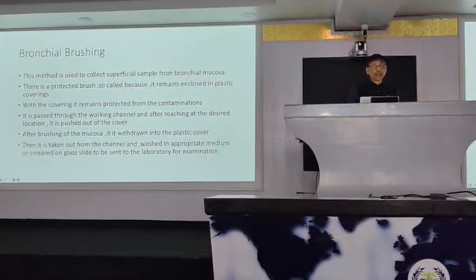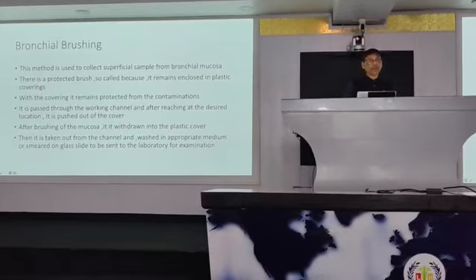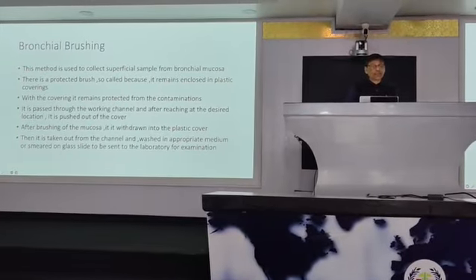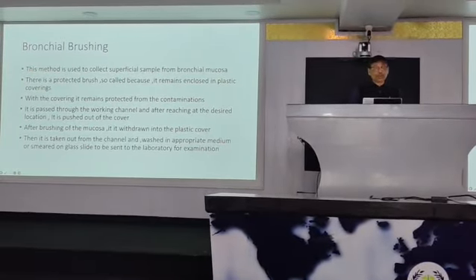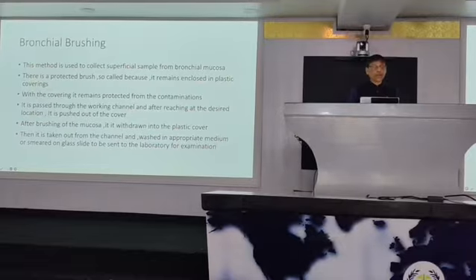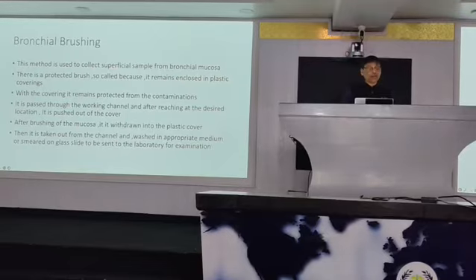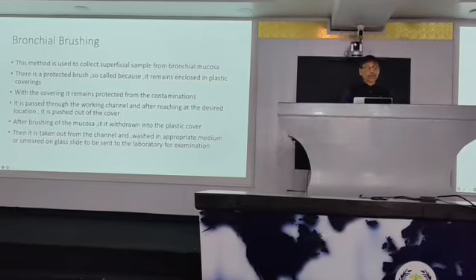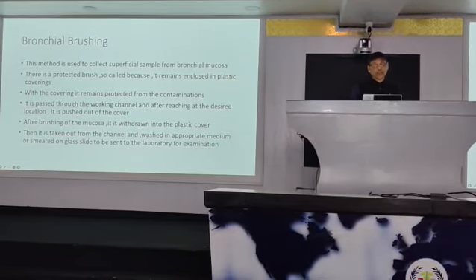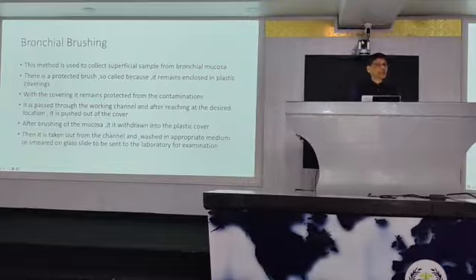This method is used to collect superficial sample. This is about bronchial brushing. It is also called bronchial brush biopsy. So this method is used to collect superficial sample from bronchial mucosa. There is a protected brush, so called because it remains enclosed in plastic coverings. With the covering, it remains protected from contaminations. It is passed through the working channel and after reaching the desired location, it is pushed out of the cover. After brushing of the mucosa, it is withdrawn into the plastic cover. Then it is taken out from the channel and washed in appropriate medium or smeared on a glass slide to be sent to the laboratory for examination.